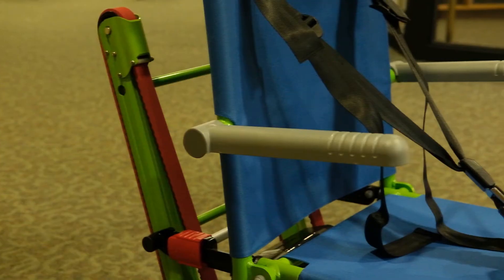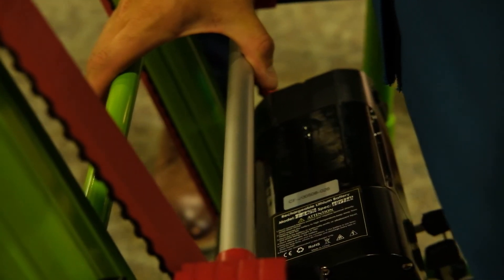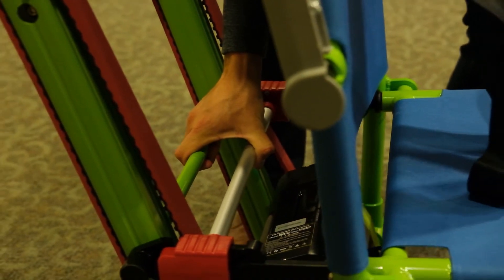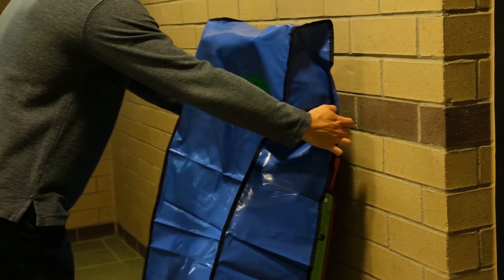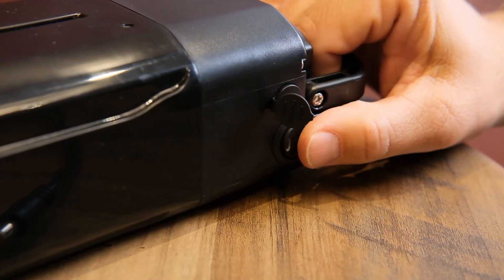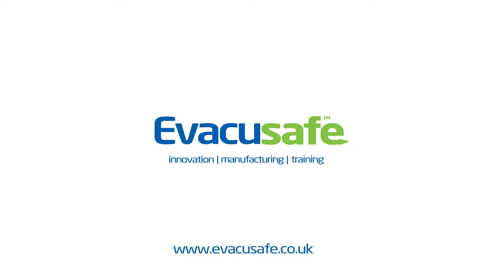Lift the handle until it locks into place. Pass the support harness through and over the handle. Next, fold the arms back and close the chair from the side by releasing the red locking mechanism on the track. Push forward from the top handle and fold the chair together. Pass the lower part of the support harness through the footrest and connect to the upper harness. Once finished, place the chair back into its storage location and replace its protective cover. Switch the power button on the battery to the off position and, if necessary, plug in the charging cable.